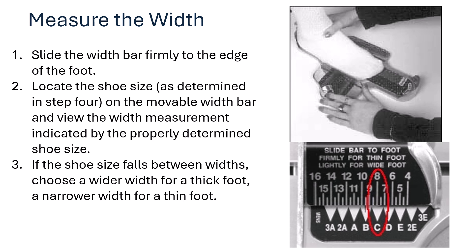To measure the width, slide the width bar firmly to the edge of the foot to locate the shoe size. Slide the bar firmly for a thin foot, and lightly for a wide foot.